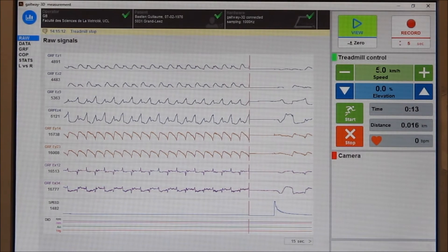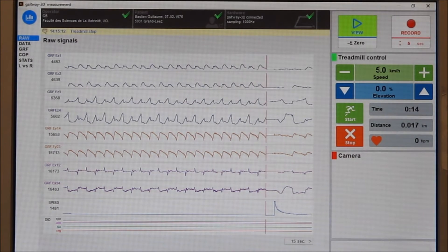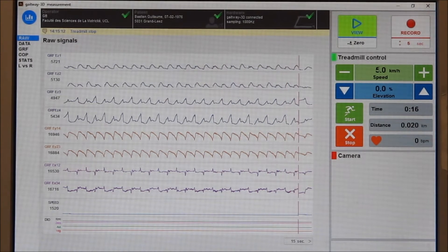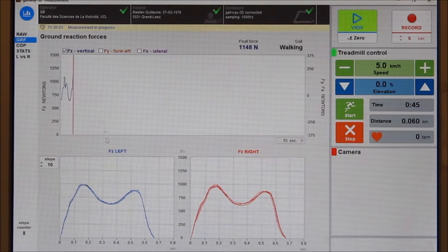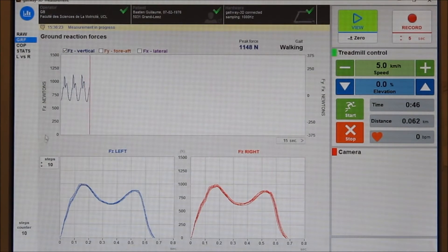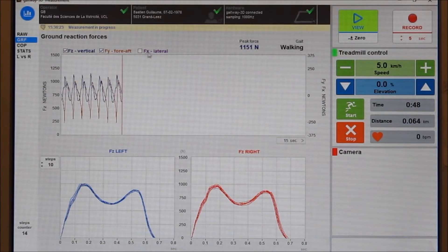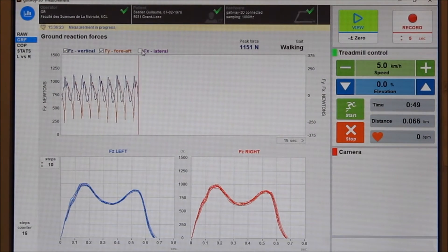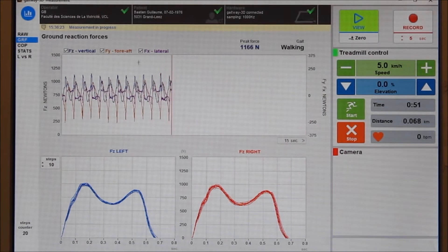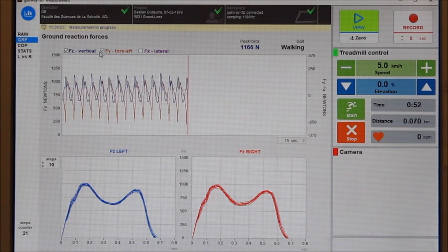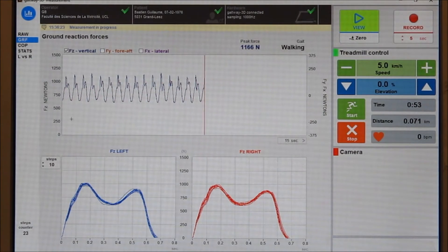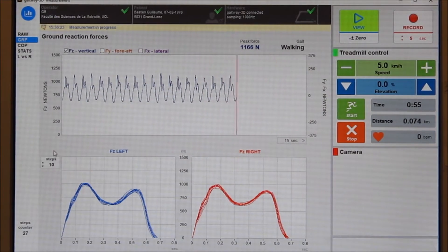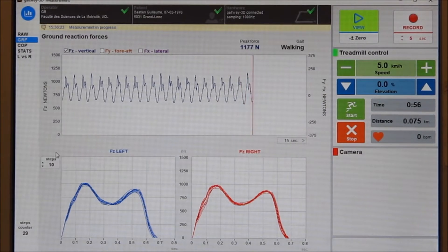The data monitoring can be started and stopped at any time via the view function. The second panel shows the ground reaction forces. The Gateway 3D measures the ground reaction forces in all three directions: vertical, horizontal, and lateral.